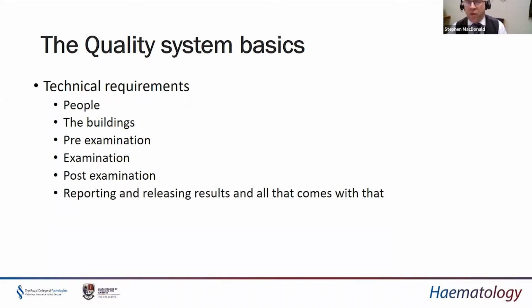It might come from another hospital, it might be from all realms of different places. How do we get the specimens, the samples, the tissues sent to the laboratory in a standardized way, so that when we do the tests, we know that that transportation and handling of the sample hasn't impacted on the quality of the sample and the results that we provide from that, and therefore the clinical outcome of the patient?